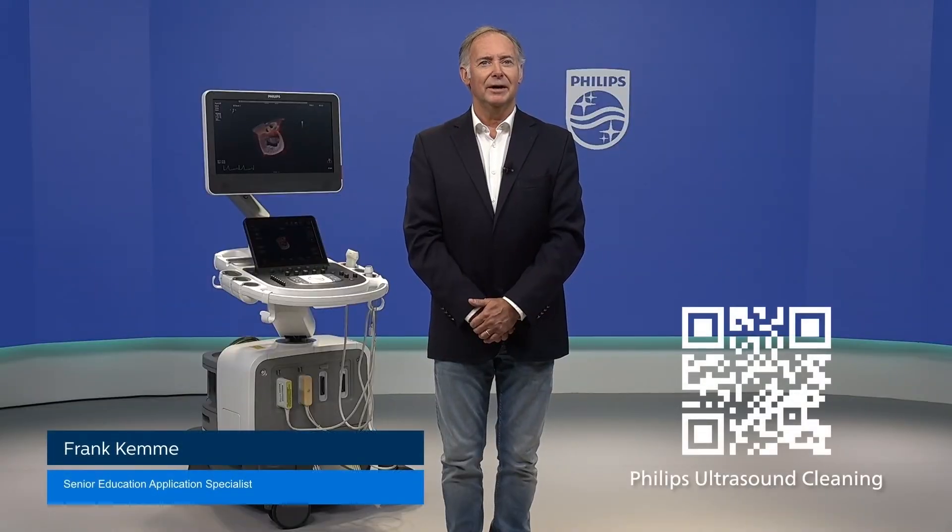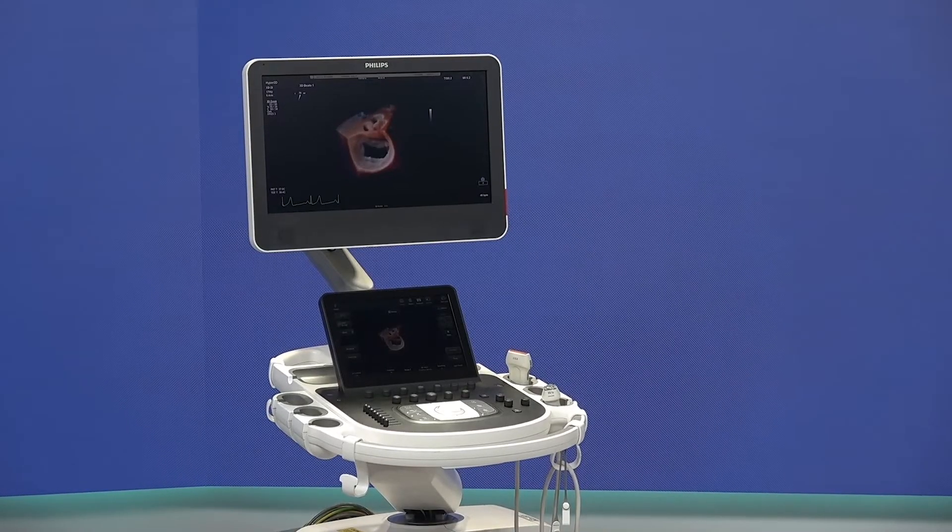Hello, my name is Frank and in this video I will explain how to clean and perform low-level disinfection of a Philips ultrasound transducer, its cable and connector, in the correct way.